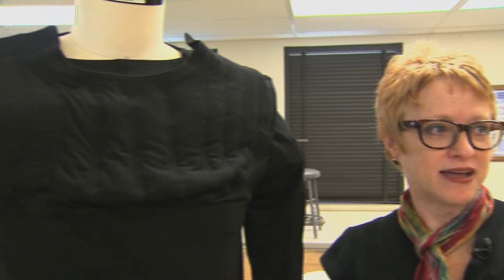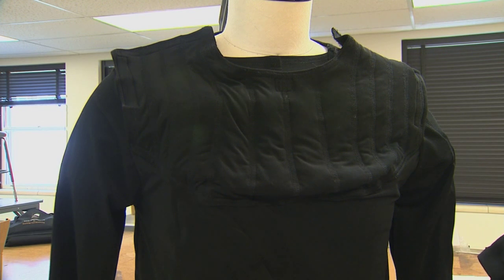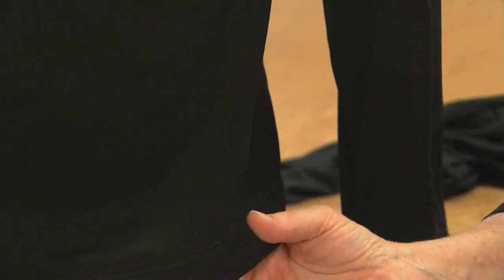Bukkaputnam originally thought of putting all the sensors, transmitters, and batteries in a big Band-Aid-like patch that would have stuck on the patient, but that might not have been very comfortable. So fashion design experts like Mary Rupert Stroescu from the Human Sciences Department were brought in to make a shirt to house the equipment. Her team had to consider which fabrics and threads would provide the best fit and function. They chose a stretchy polyester lycra fabric because it's comfortable and wicks away moisture. It also let them design around the need to attach heart monitoring electrodes to the body.